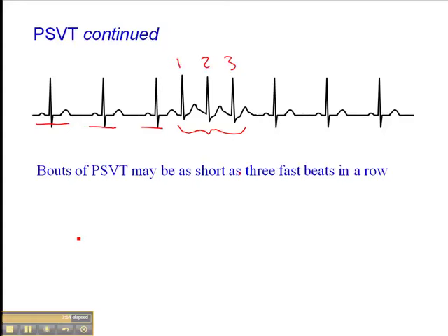Oftentimes this is what we see with PSVTs — these short bouts. From a clinical perspective, what's important to ascertain when patients have either sustained SVT or PSVT is what are their symptoms during that tachycardic phase. Do they become lightheaded, dizzy? Does their blood pressure drop? Do they become nauseated, vomit, or lose consciousness — a syncopal episode? Do they become pale? It's important to document how fast the heart rate is, how long the tachycardia is sustained, and the patient's clinical presentation during that bout of PSVT.